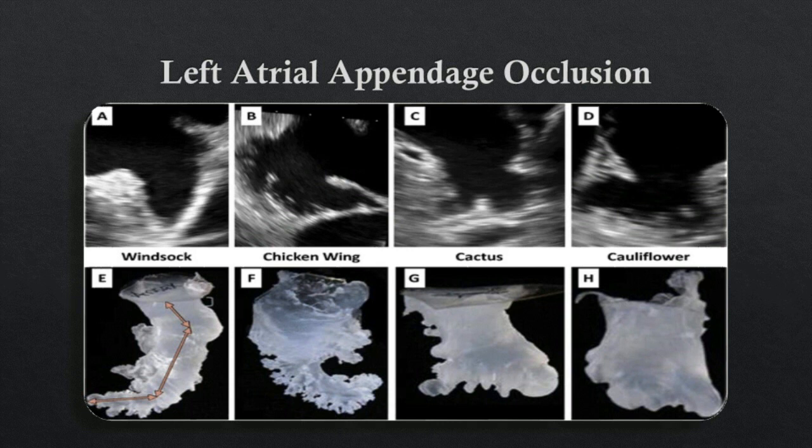Imaging is key in structural heart procedures as it enhances the operator's ability to navigate patient-specific anatomy. A left atrial appendage occlusion requires transseptal puncture. In addition to high operator skill, the image guidance aids in this process. Echo imaging is used for sizing and during the procedure, as well as fluoroscopy to determine the best angulation for the device deployment.